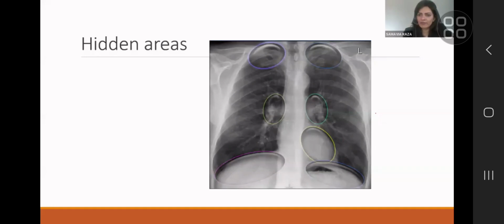So you're not going to get a very accurate history, because a junior doctor somewhere has filled out a request the consultant asked him to fill out. So the request will be something along the lines of pathology question mark, or normal question mark. We get all sorts of simple requests these days, don't we? So apex first and the most important one.